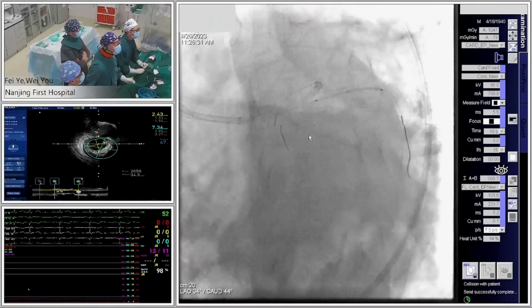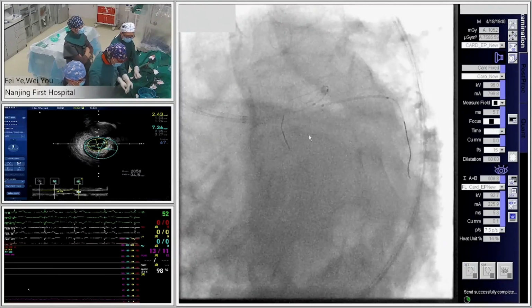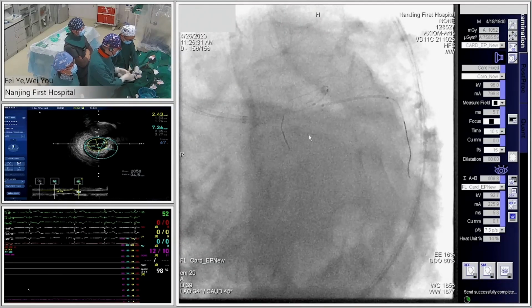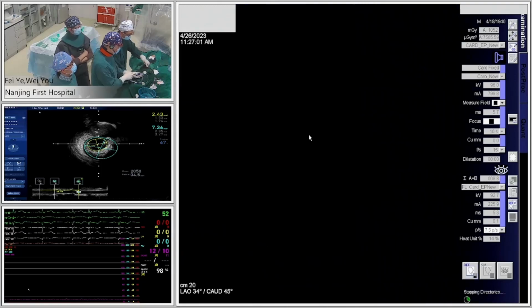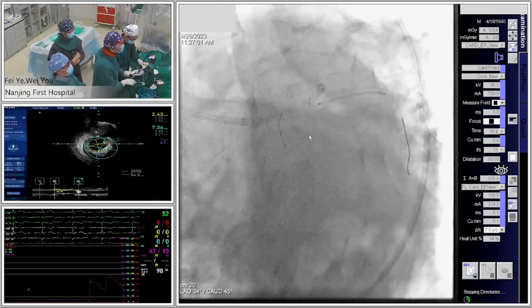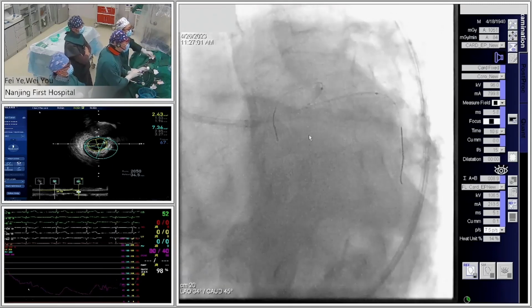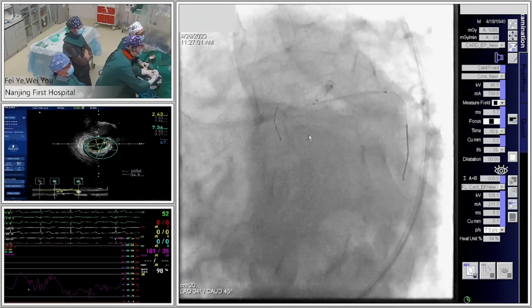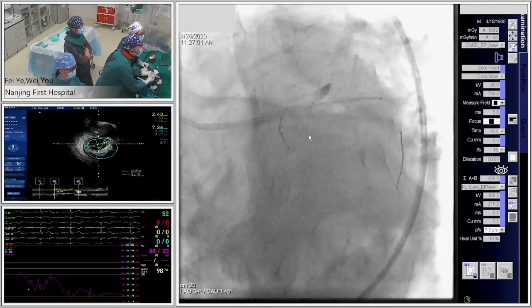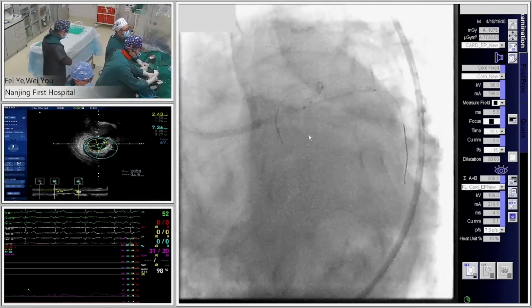So it's very important to push the NC balloon distally with a size as approximately the vessel. What's the size of the NC balloon? 3.5. Yeah. What's the length? The length is 12 or 15. Okay, 15. So make sure the stent fully covers the whole region of the side branch, especially the ostium. It's very important that we cannot avoid this.